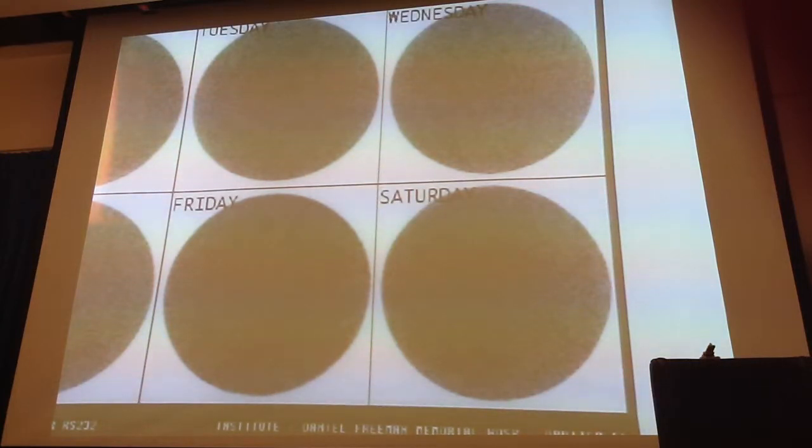Well, one of the things you guys have to keep in mind is, uniformity means that every day you do this, it has to be done the same way. Same number of counts, same intensity, nothing varied from the day before. So, just give me a second here. Let's see that. I don't know how these other images are in here. But edge packing.